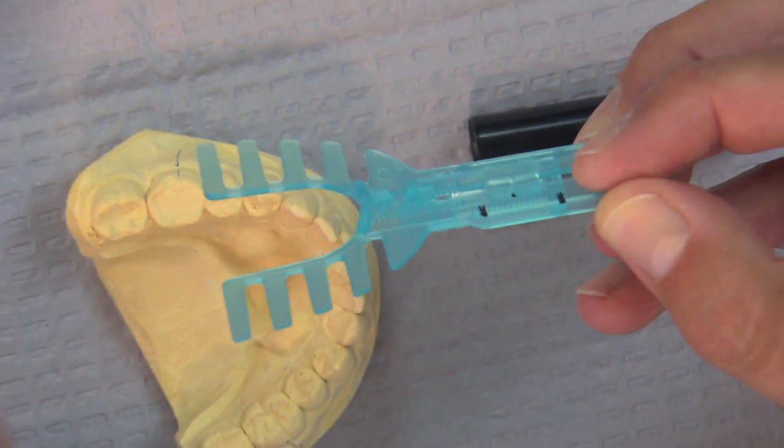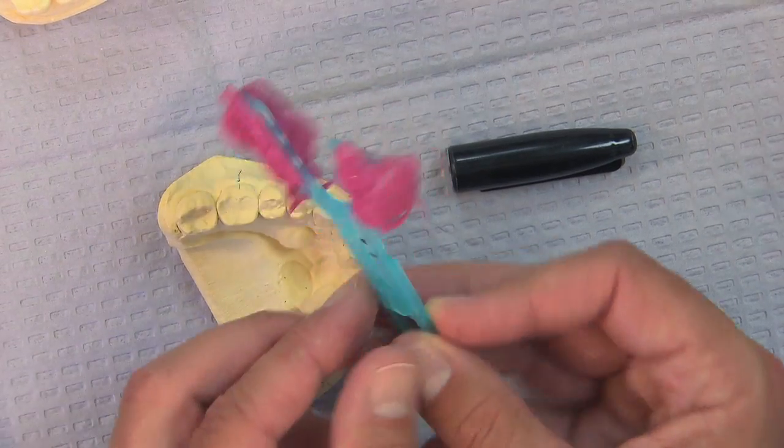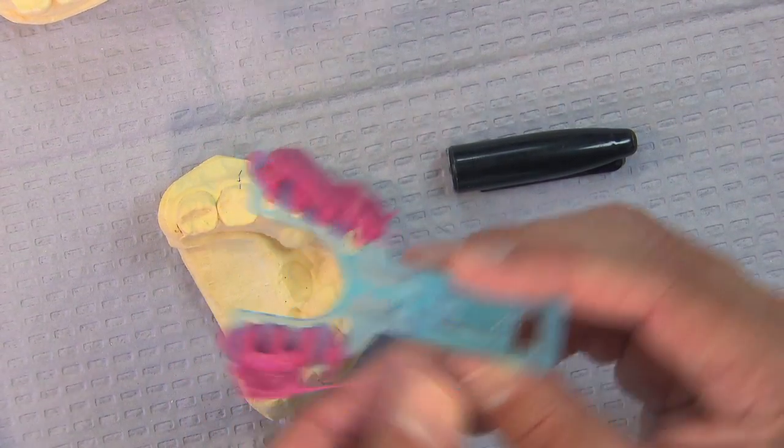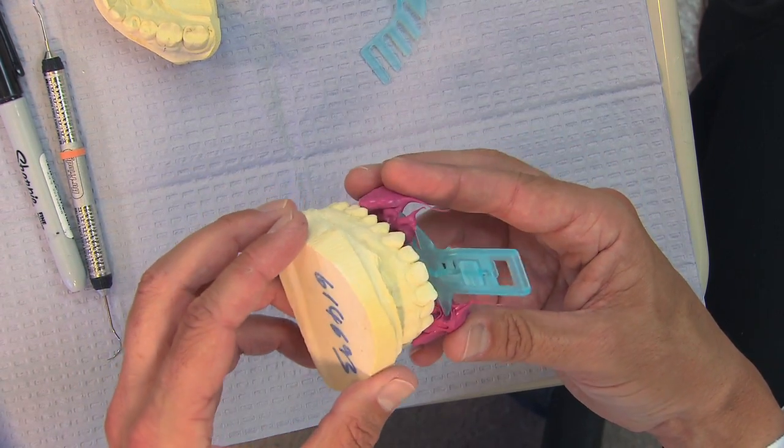And you'll see me do this in just a second on the patient. And it's going to end up looking like this. And this is really all you need, some indentations of both the teeth from the upper and lower jaw. So we're going to be able to take this and seat the model into it.